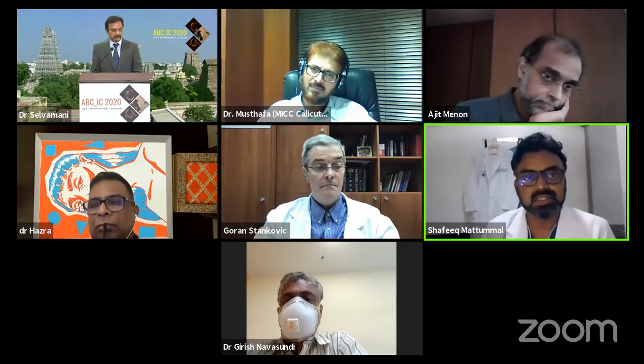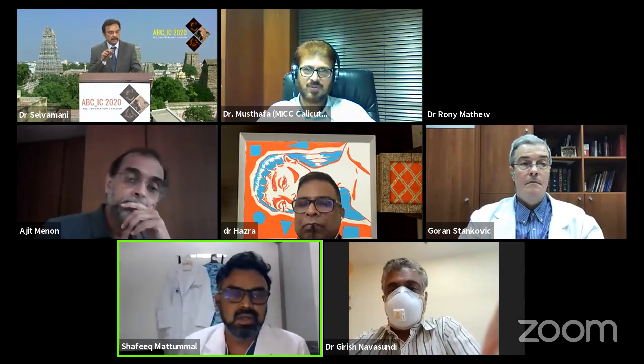So the decision whether or not you have to cross again to the side branch and do a kissing is absolutely up to the result after. But always we address the main branch fully, and we make sure that the main branch is deployed fully. And after the POT, if we need to recross and do the kissing, do not hesitate. Just complete that process. And as you rightly said, if the proximal LAD is longer and calcific and a lot of length of stent is planned before the origin of the diagonal, this is not a good idea.